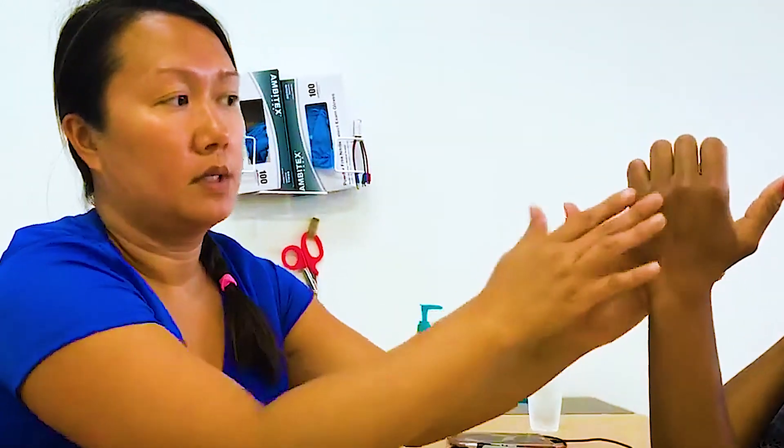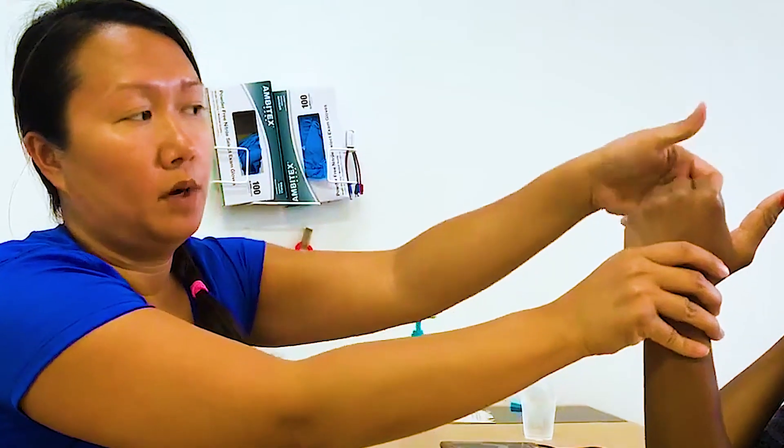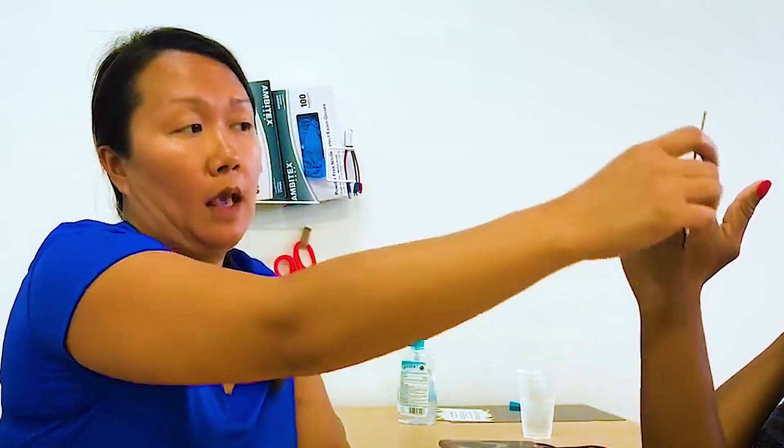Every once in a while there will be people who, when they make a fist, their IPs curl and their MPs extend. But when they open up their IPs, their MPs extend, but then they can't fully fist. That's a different type of problem — you just have to notate it. But that's how we measure MP and IP flexion and extension.